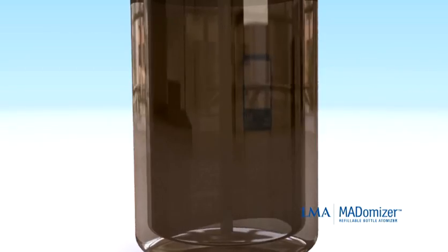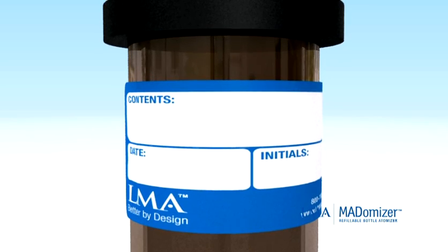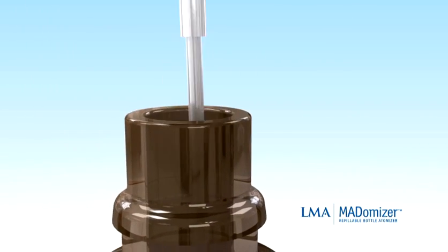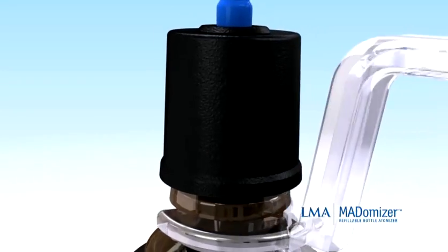To prepare the MADomizer bottle, fill out and attach the provided label to the refillable bottle. Unscrew the pump from the bottle and fill it with the desired topical medication. Thread the pump hand-tight onto the bottle.